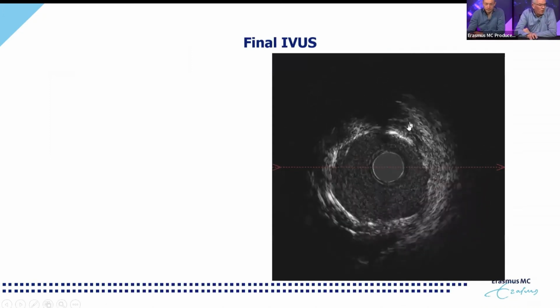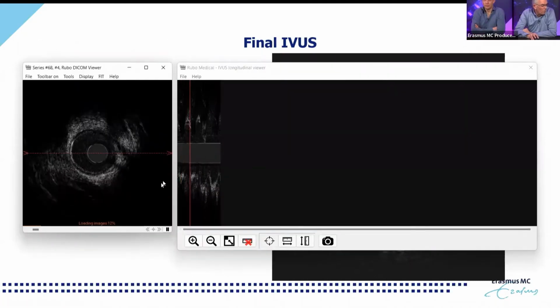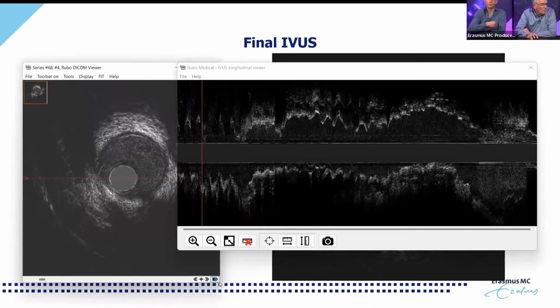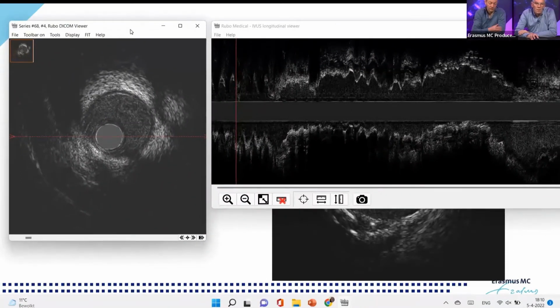So interestingly, here we did not repeat the angio, and I think that is another advantage of IVUS, that you really use less contrast, because if you do some optimization, like in this case, of course you could do an angio, but at the end, the angio would have virtually no implications, whereas you immediately do the pullback, you save the contrast of another cine run, you save the radiation, and you get the best imaging, let's say better quality imaging than when you would have done just an angio.